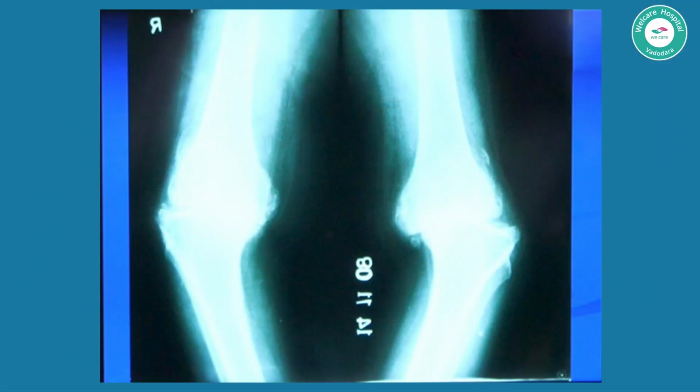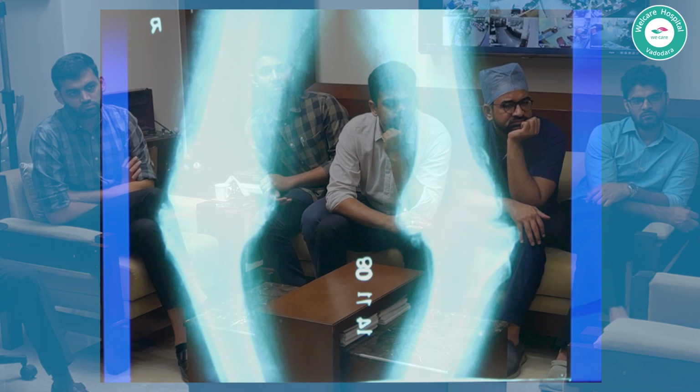Because if you leave it in too much laxity, the patient will still have a waddling gait. There will be a lateral lift off, so that with every stance phase of the gait cycle, the medial tibial plateau plastic will be loaded hugely, and therefore there will be an earlier failure of the plastic. So ideally you should not have a lateral lift off.